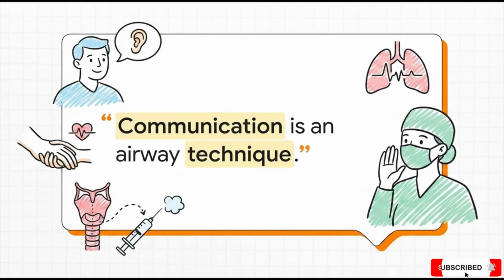Communication is an airway technique. Honestly, this might be my absolute favorite concept in this entire explainer. Patient cooperation is a literal medical necessity here, and you achieve that through calm, crystal clear communication. You have to explain to the patient that their airway will be numbed. You tell them, hey, you might feel some pressure or a weird sensation in your throat, but you reassure them that they will continue breathing easily the whole time. A calm, well-informed patient is vastly easier to intubate than someone who is frightened or panicking. Your words are quite literally a clinical tool.